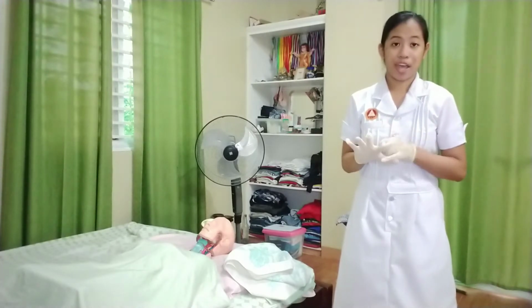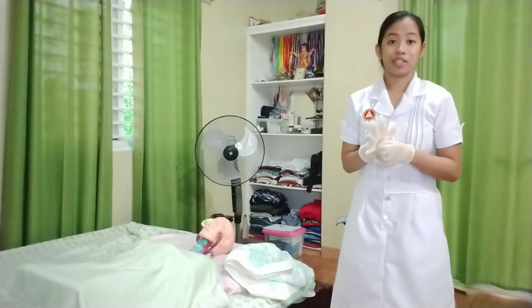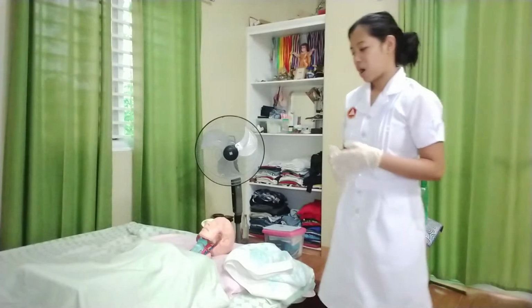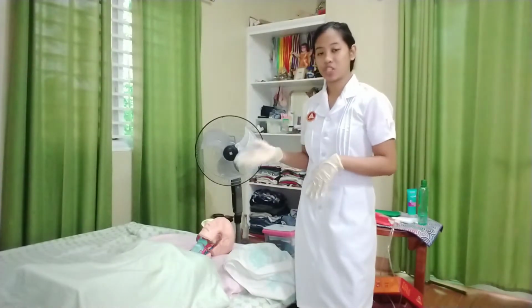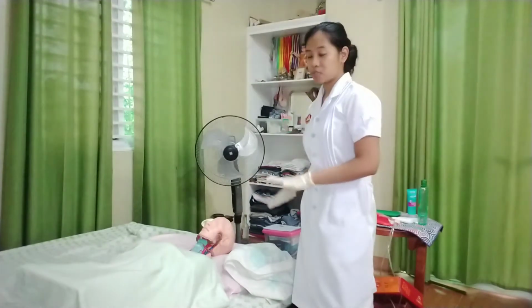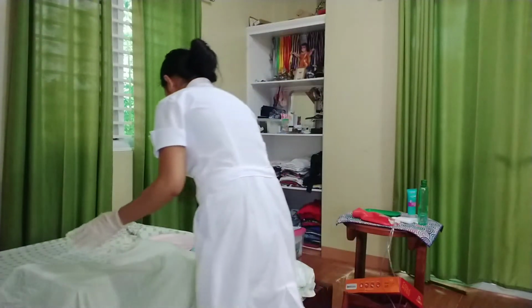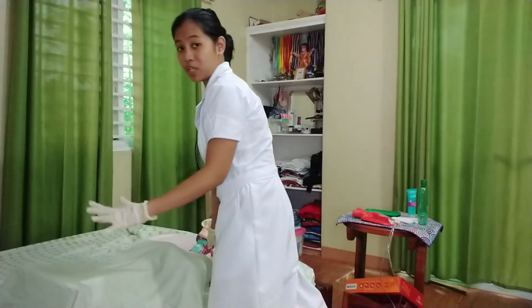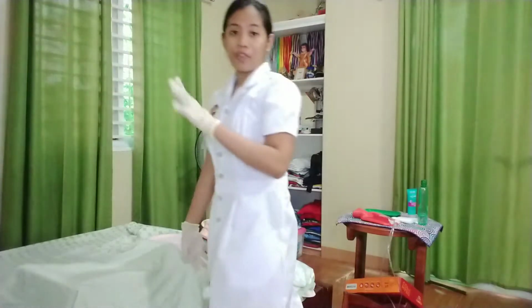And I will also provide adequate lighting for me to have a clear visualization when I start the enema administration. So after that, I will now assist my patient to a left lateral position with the right leg flexed, and I will make sure that the disposable pad is under the buttocks area. So ma'am, I will start na po the procedure, so let me just turn you on your left, assuming that we will have the right leg of the client flexed.